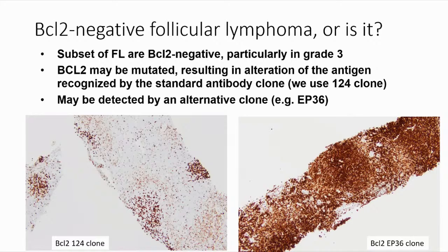Other markers such as CD43, again, you don't always win. They may not be CD43 positive, but if you see the B cells are increased and you've really got convincing CD43 on them, that can help you establish that diagnosis as well. But it can be challenging. It depends how well developed it is. Some you see just a beautiful expansion with nice monocytoid features, lymphoepithelial lesions, and associated clonal plasma cells, but not always that good.